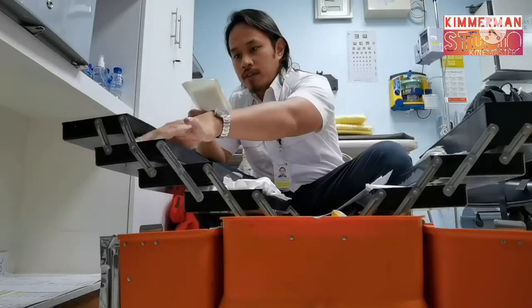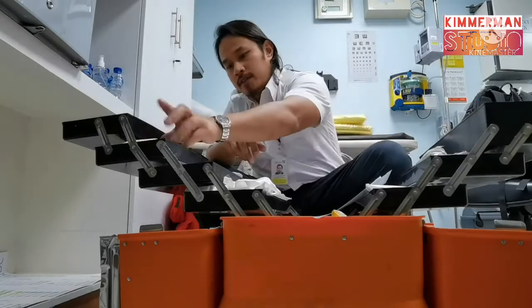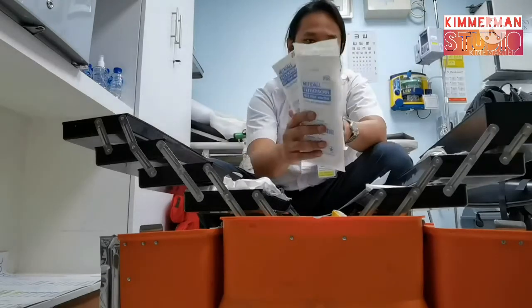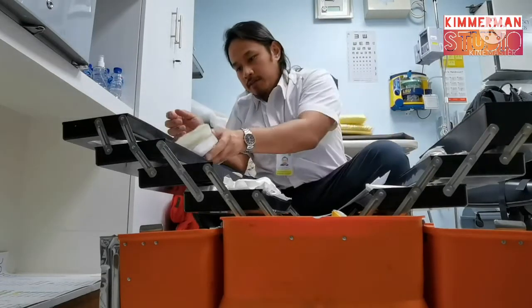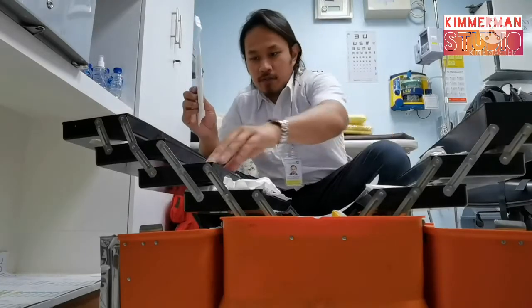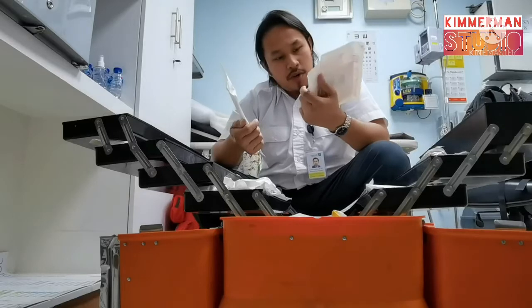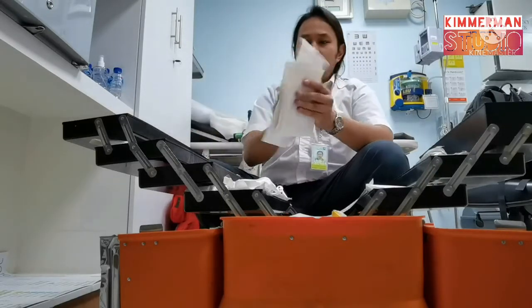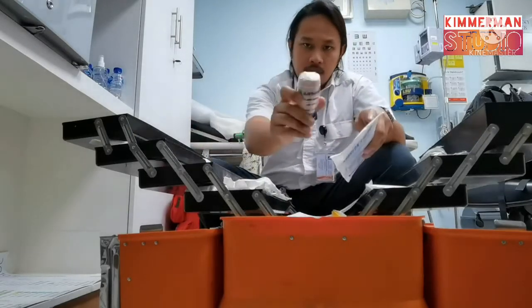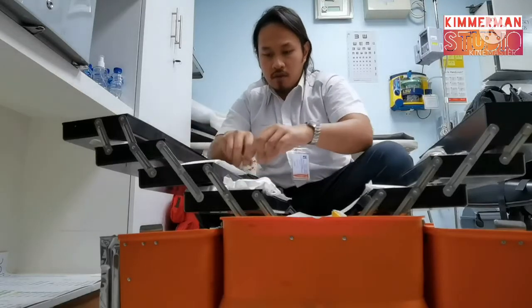Second shelf, we have this infusion set. Okay, not expired. Another infusion set. Abdominal pads. So, not expired. Two Micropore. Third shelf, we have examination gloves, sterile gloves, size 8 and size 7.5. Not expired. Other bandages, plastic bandages, also another bandage.